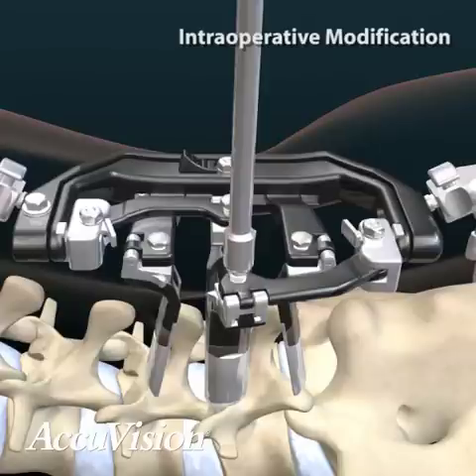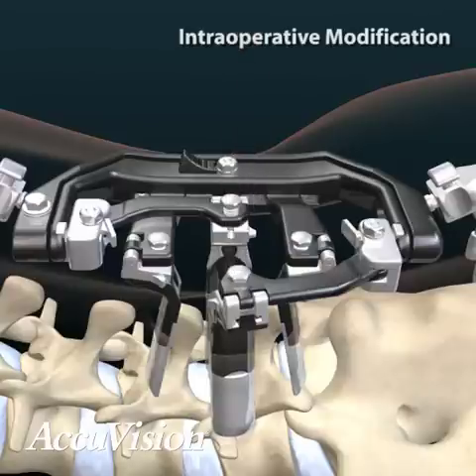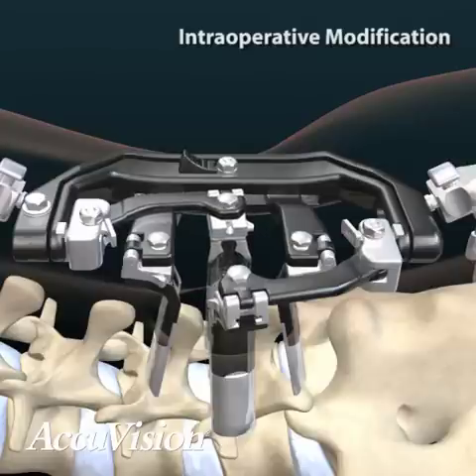An additional retractor arm module with the desired length blade can be secured onto the opposite dovetail connection on the retractor frame. When complete, the assembled frame provides 4 points of retraction, allowing generous visualization to perform the indicated procedure.